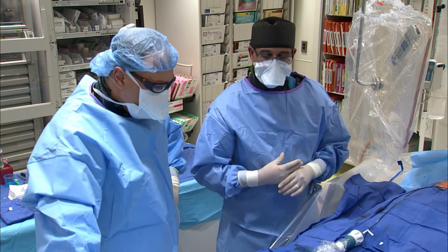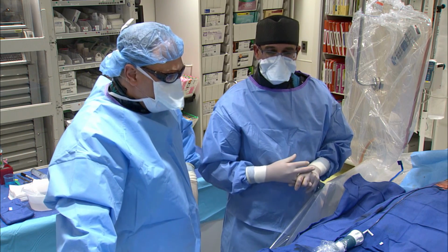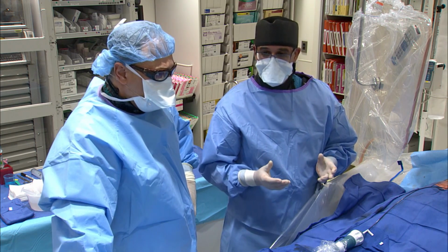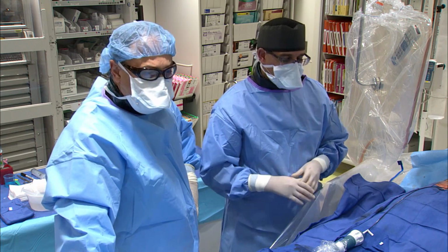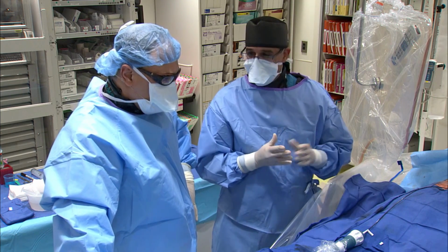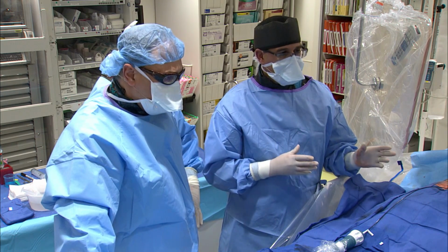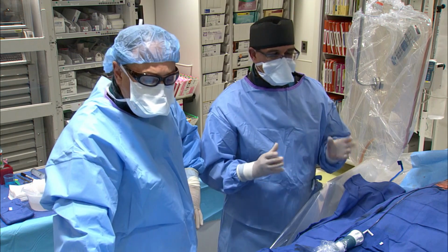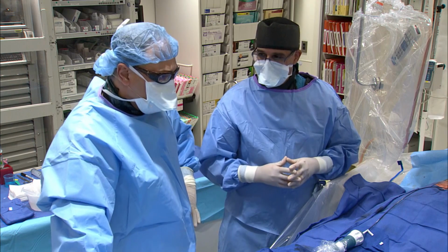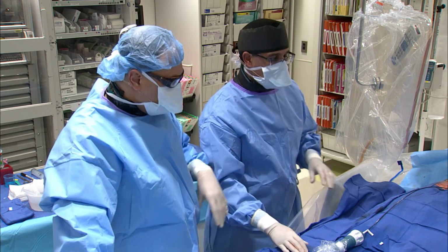Other issues that you would want to make sure you didn't have is pulmonary hypertension with elevated pulmonary vascular resistance. So you don't want to have an undiscovered Eisenmenger and then you close up the hole. So this is a perfect case because it's an atrial septal defect septum secundum. She has good anterior and posterior rims. The size unstretched is 12 millimeters. So again, that makes it a simple ASD. Now, I hope we won't eat our words having said that.